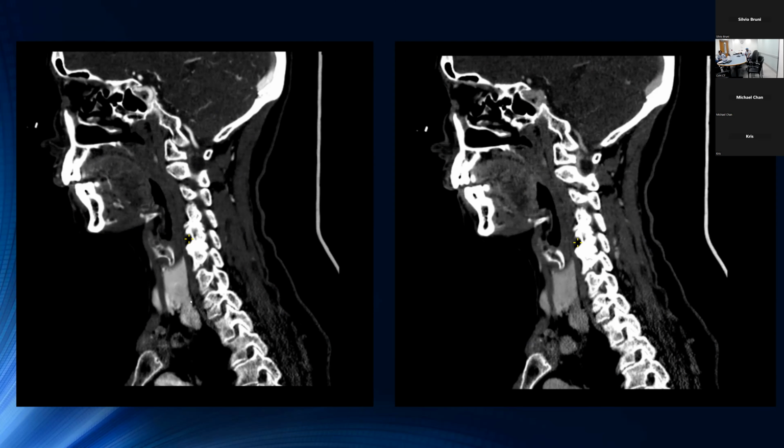And here you can see, in this case, there's this lobulated soft tissue at the inferior aspect of the thyroid lobe. In this case, maybe there's a thin cleft that separates the two, but it looks like you lose it in some areas. So, question of maybe this could be an exophytic thyroid lesion rather than a parathyroid lesion.